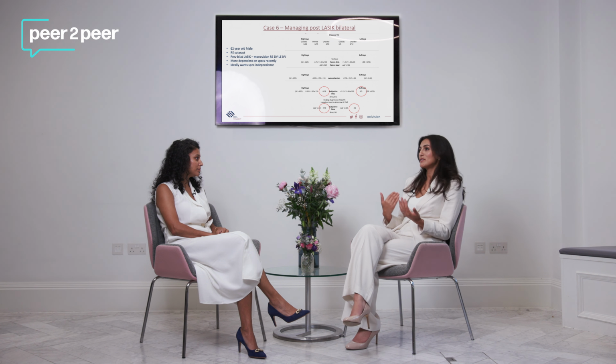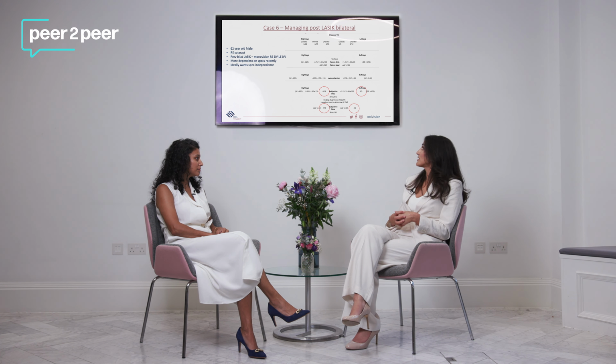He told me that he had around a -1.5 difference between the two eyes after LASIK. So he wants more spectacle independence. He only wants his right eye operating at the moment. And the question is how we approach this and what type of lens we use.